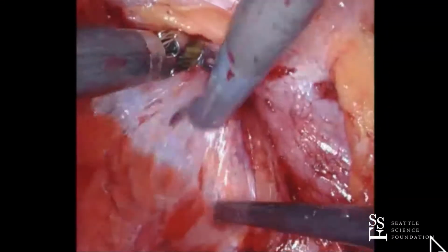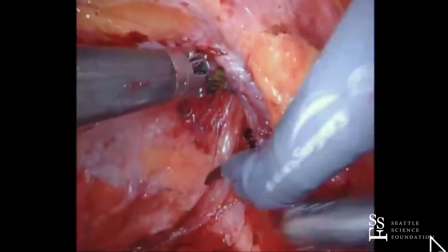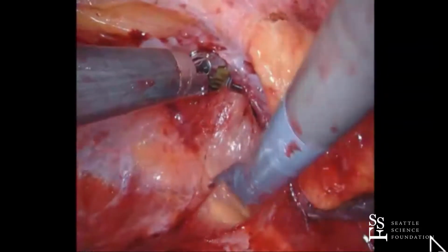Yeah, the psoas is a great landmark. If you ever get lost in the retroperitoneal space, just go look for the psoas, and it reorients you.